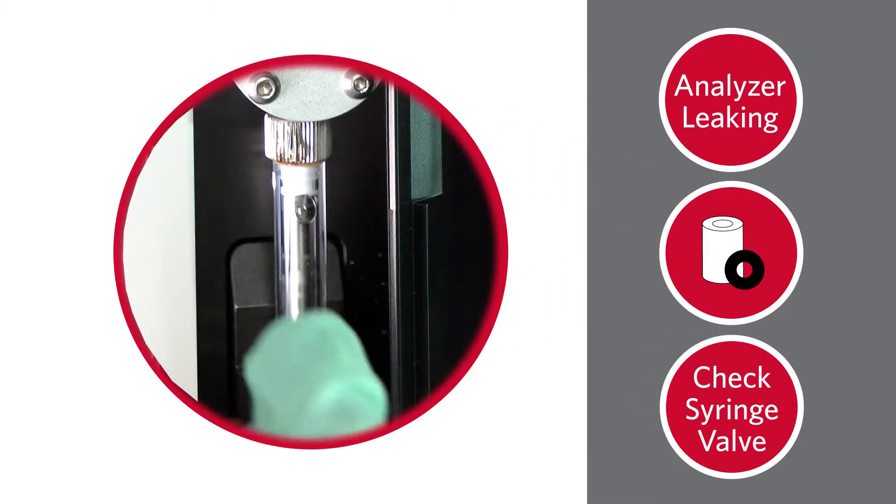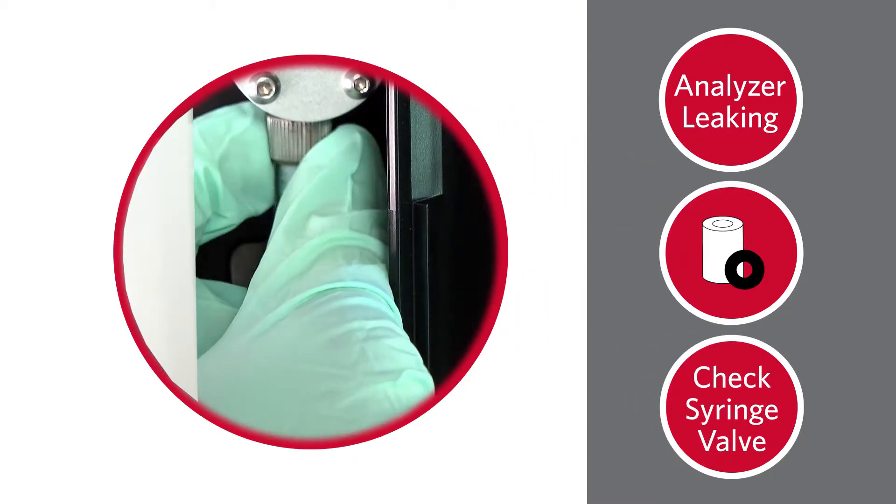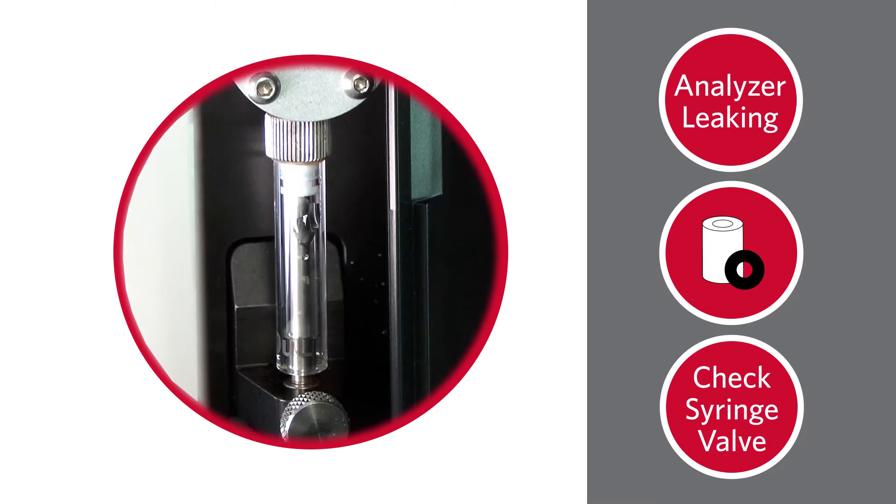If the syringe valve is leaking, hand tighten the silver syringe connection on the syringe valve.